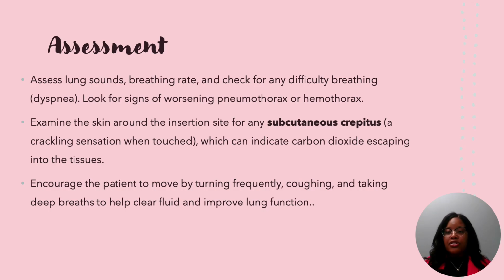We want to make sure that there are no kinks in the chest tube. If the patient is hooked up to wall suction, we want to let them know they should not be unplugging this to go to the restroom and things like that. You want to teach your patient not to sit on the chest tube, to keep the chest tube unclamped, not to mess with the chest tube, and not to pull it out. So you want to make sure that you're assessing your patient, okay?